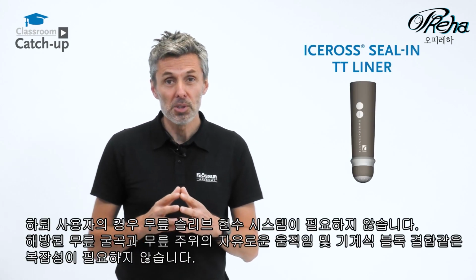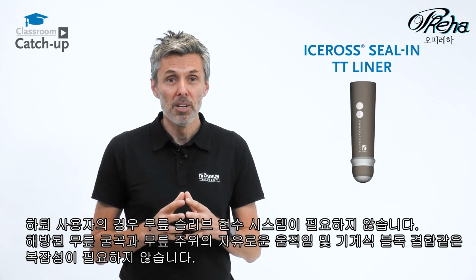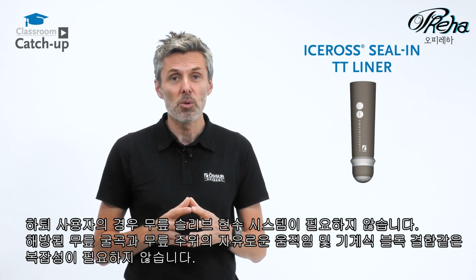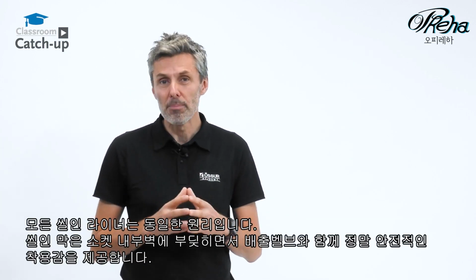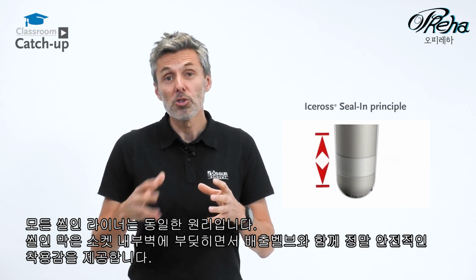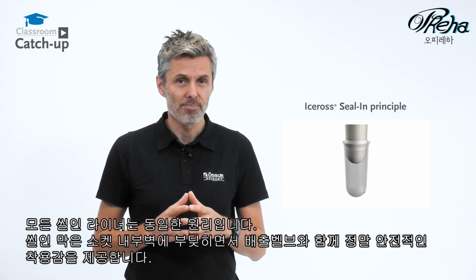For transtibial users, it didn't need a knee sleeve as part of the suspension system, liberating knee flexion and freedom of movement around the knee, and also didn't need the complexity of engaging with a mechanical lock. Now, all seal-in liners use the same principle, and that's where the seal-in membrane seals against the inside of the socket wall, and used in combination with an expulsion valve gives a really secure fit.